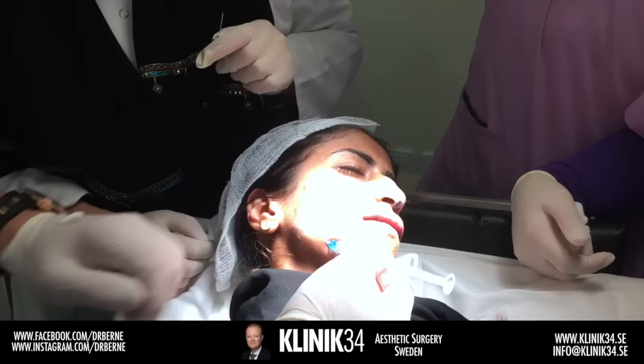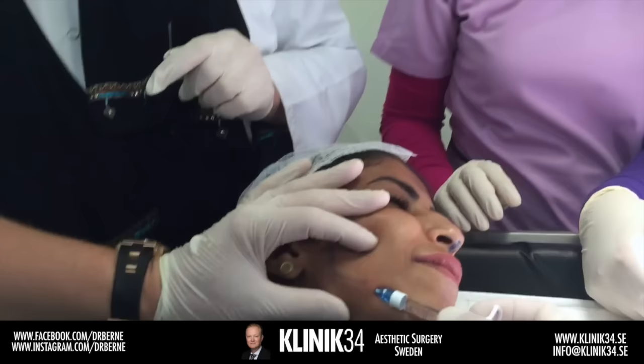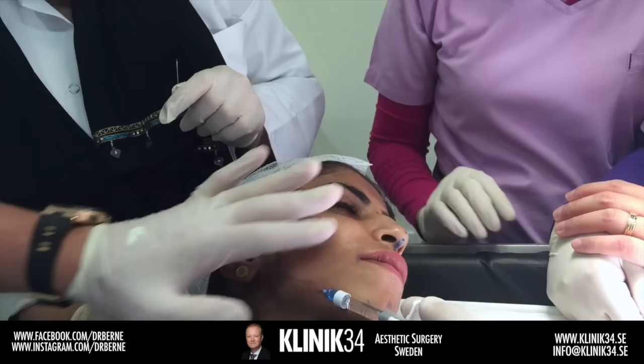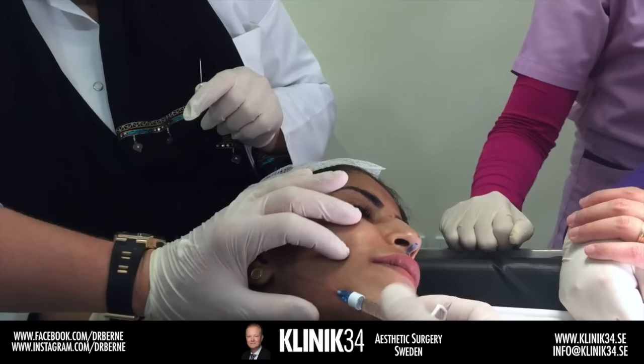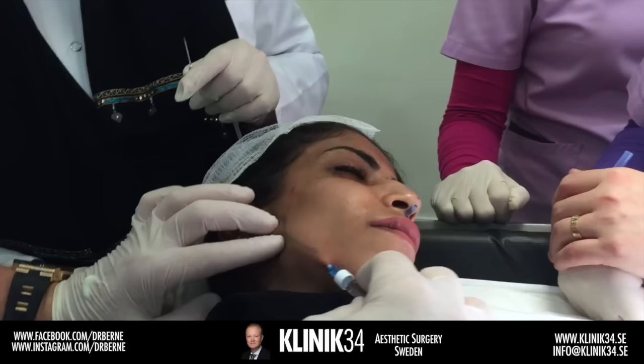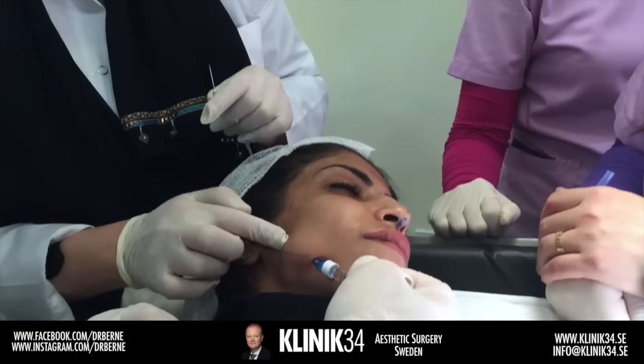That was 0.5ml and I try to hold my syringe very gently to find the right layer for injection — I feel it's quite deep. It's a linear injection or fanning as we always do with micro-cannulas, but I'm not thinking lines or fanning — I'm thinking about creating the shape I want. Now going up here, either I use a new entry point or I push it up, and you can see the gel coming through there.